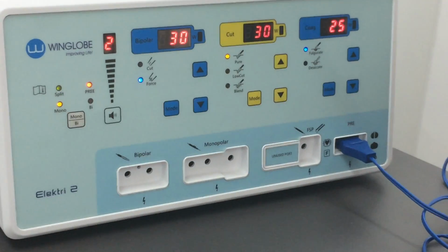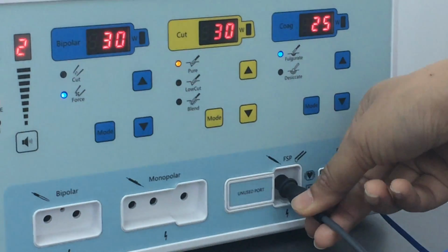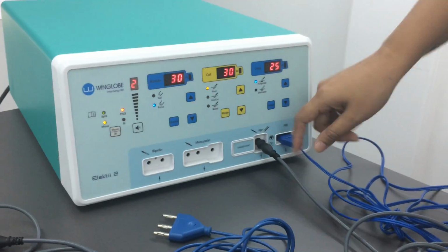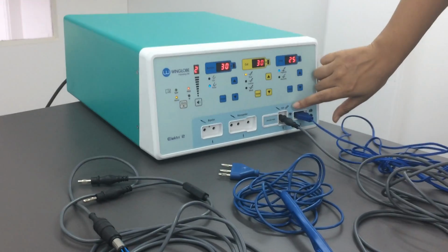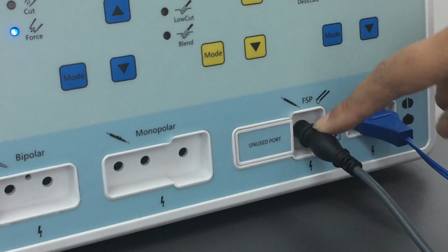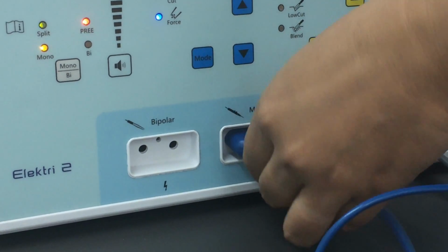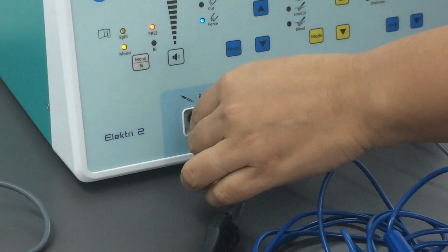Then your foot control monopolar reusable pencil is a single pin monopolar electrode, which will go into your foot switching port. Any of your other laparoscopic monopolar instruments will also come with a single pin monopolar cable, which will go into the same port, as well as, you can see the symbol, for all your resectoscopes for TURP or any hysteroscopy procedure, which will also be connected here for procedures under glycine. Then we will connect our disposable hand switching monopolar pencil and then the bipolar cable.